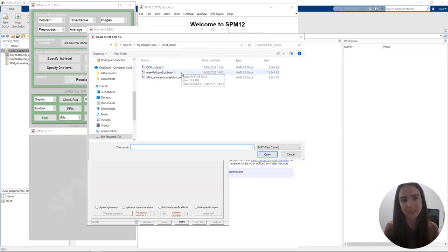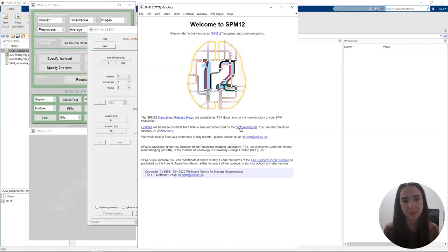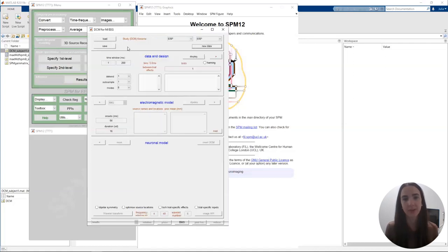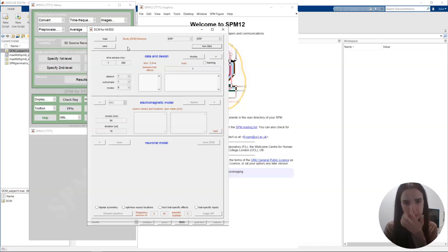We're going to start by loading the data. To do that we click on New Data and select our data file. Once we've loaded our data, we can start looking at the different settings and options available.